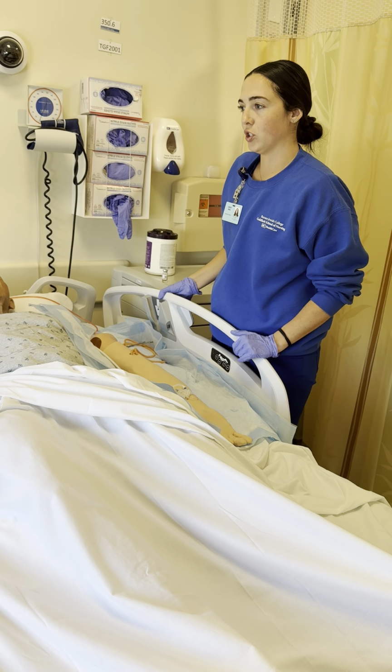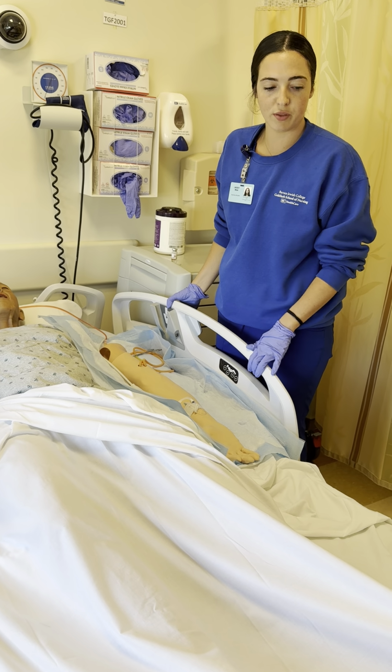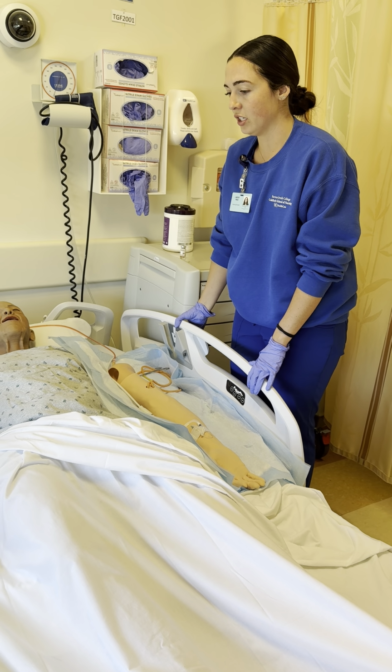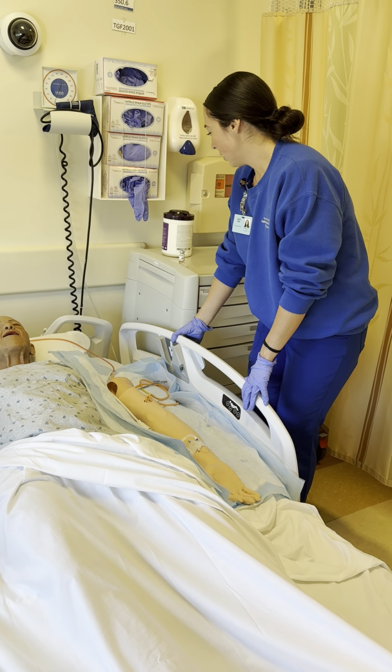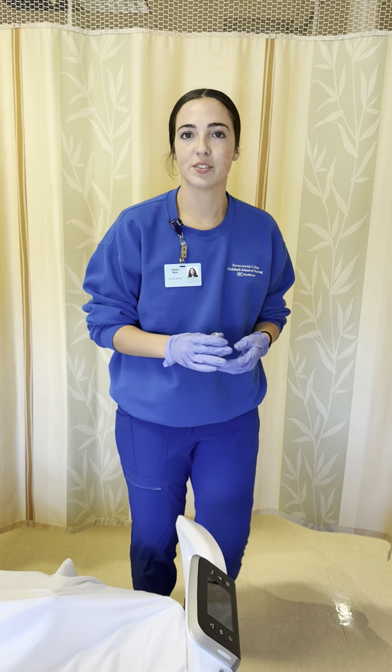Alright, so while I'm lowering the bed, I'm going to make sure that all of my supplies have been thrown away. That IV is in a comfortable position, everything looks good. I'm going to grab any supplies that I need, and I'm going to be sure to document everything now that I'm finished.